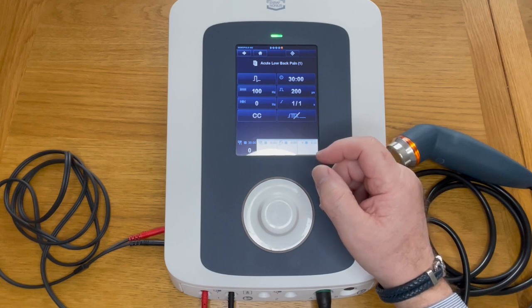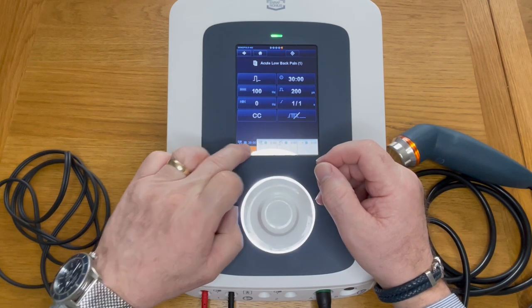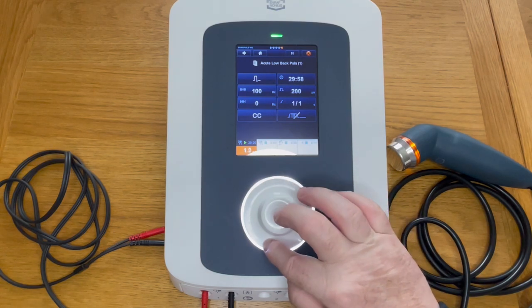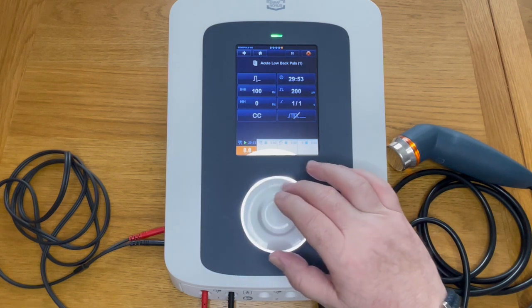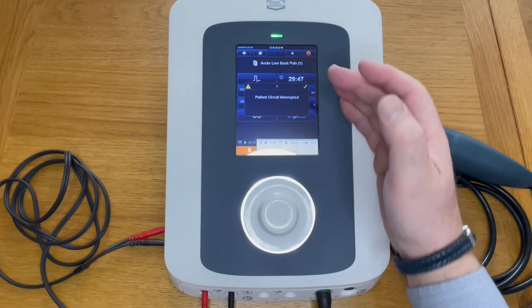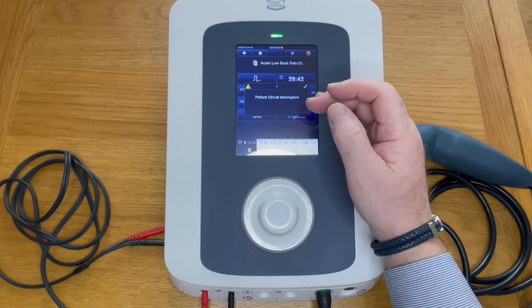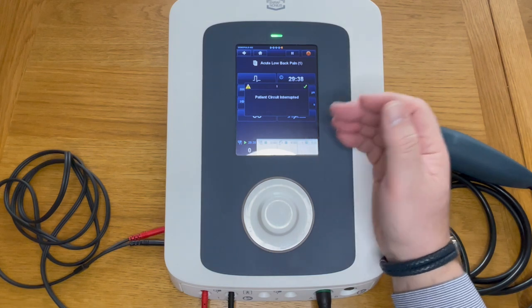This is constant current as opposed to constant voltage. Constant current is probably the better setting to ensure you do not have a possible hot spot underneath an electrode. When you press to increase intensity, if you go above around eight milliamps it will read 'patient circuit interrupted' — meaning you haven't placed the electrodes on the patient, so you can't increase intensity without placing them first, and therefore cannot give the patient a shock.